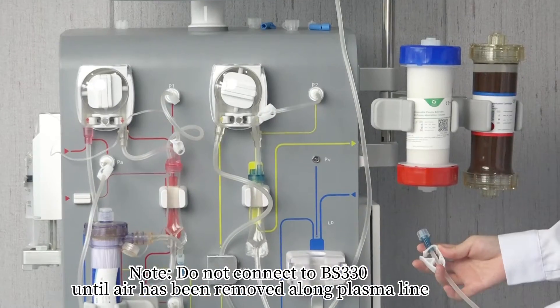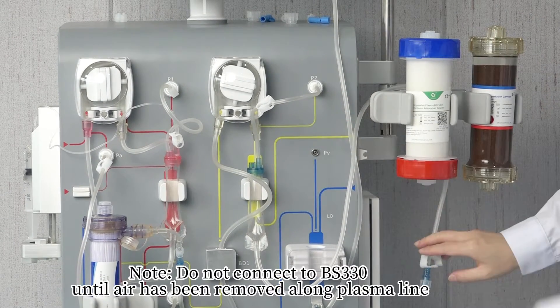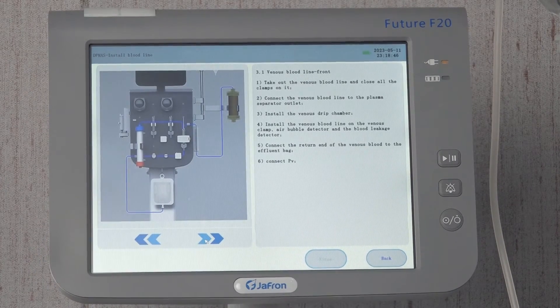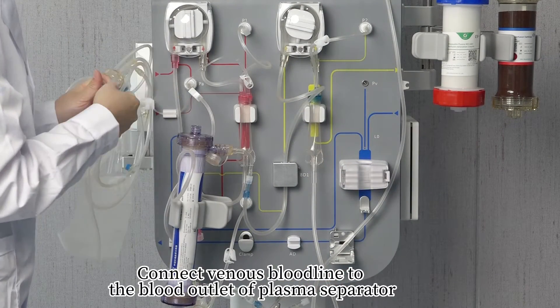Do not connect to the plasma separator or to the BS-330 until air has been removed along the plasma line. Install the frontal part of the venous bloodline. Connect the venous bloodline to the blood outlet of the plasma separator.